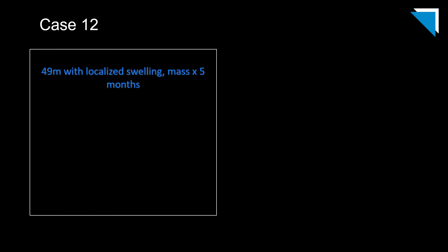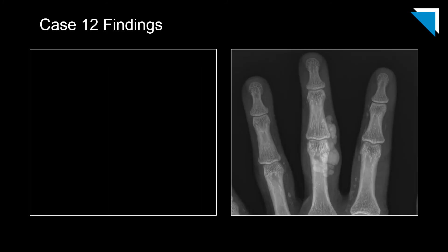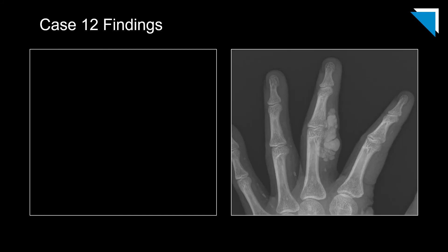Next, let's take a look at a 49-year-old man with localized swelling and a mass for five months. Here is a coned-down PA radiograph of the middle finger and the corresponding oblique view. You can appreciate the globular radio-opacities in the soft tissues along the volar radial aspect of the proximal interphalangeal joint. Notice how smoothly marginated these are, relative to the hydroxyapatite deposition we saw in the last case.